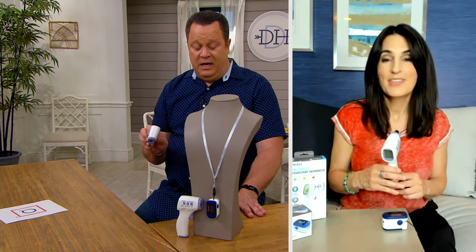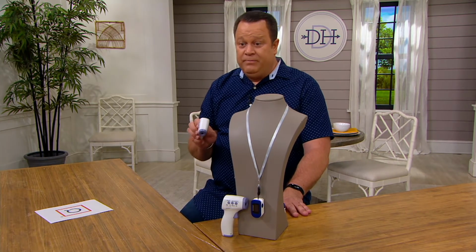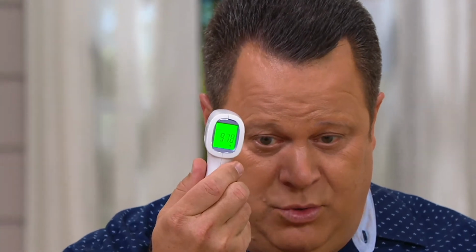Oh, I just checked my blood oxygen saturation level. I'm at 99%. Oh, you're good. Now, let's also take my temperature. Oh, it's green. And you may not be able to read. Yeah, can you read that? 97.8. Perfect.